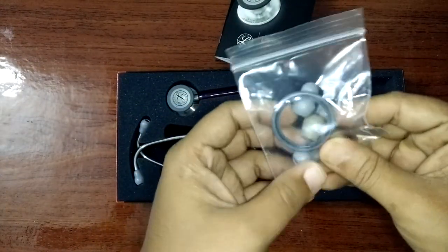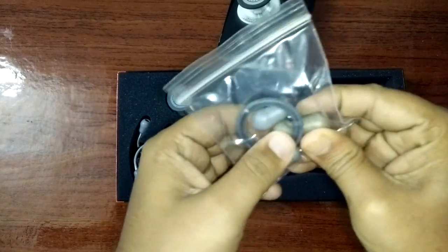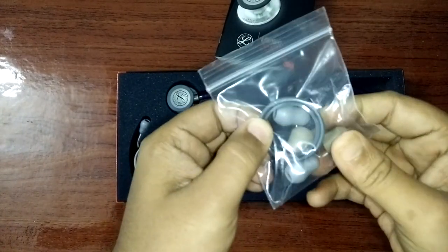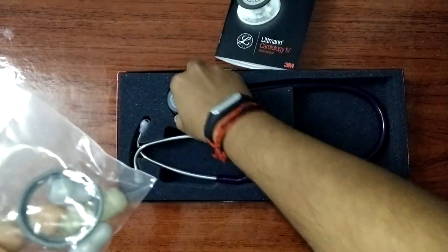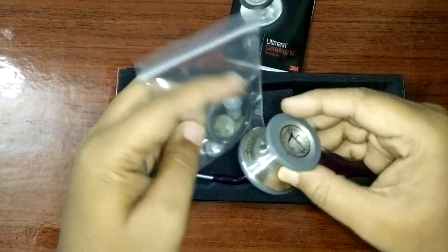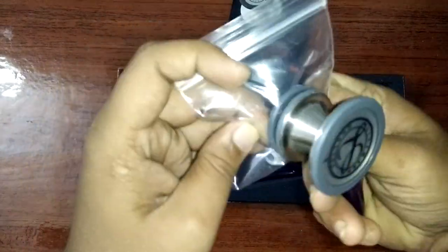And some earpieces — one is soft and one is hard. And the ring, I'm not sure what it is. I think it's a replacement for this item.